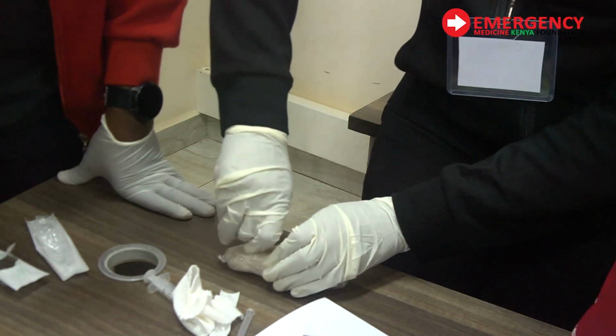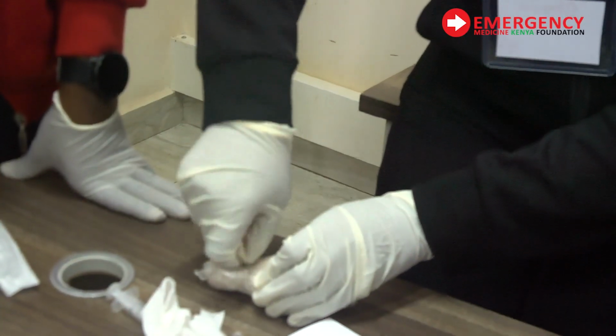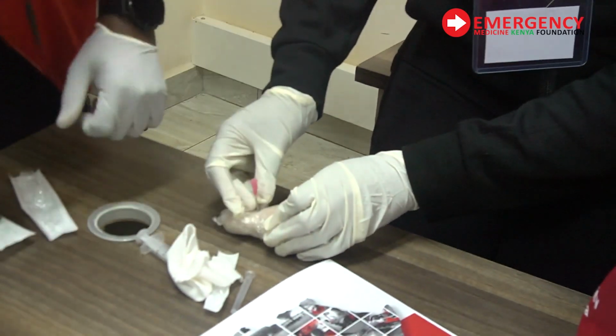Then you are using the same gauge 18 to take bone marrow? Yes. So you need a bigger needle. The one for blood transfusion is gauge 18, but it's bigger than this.